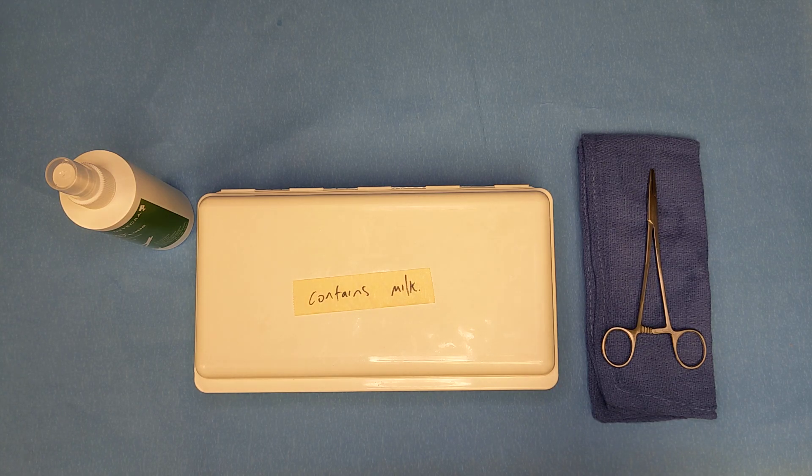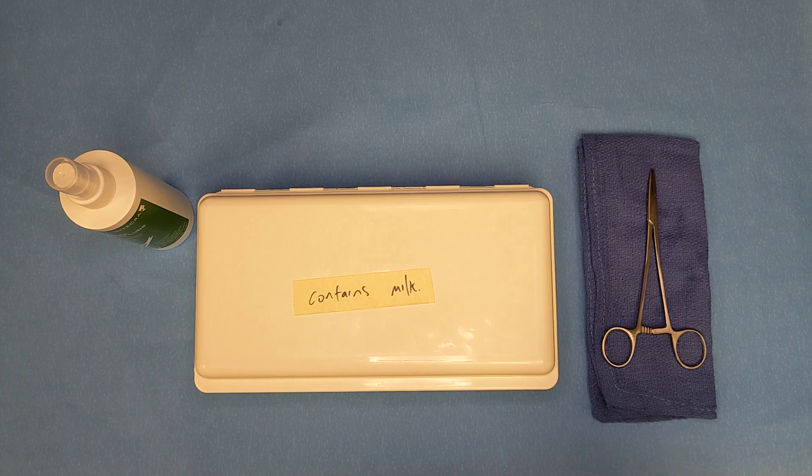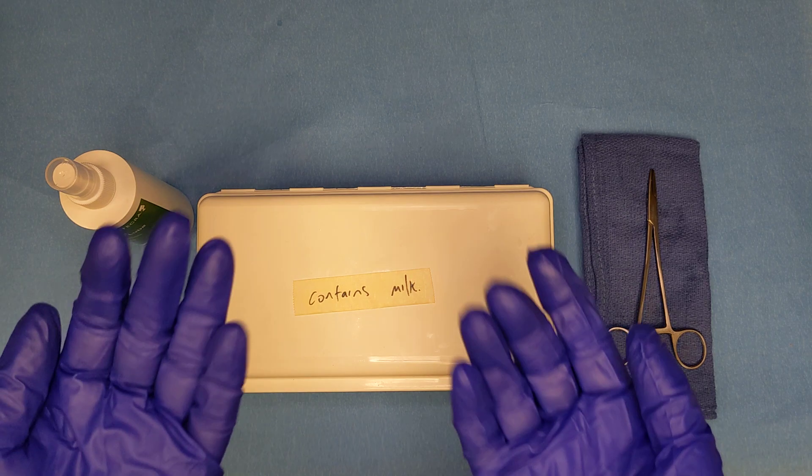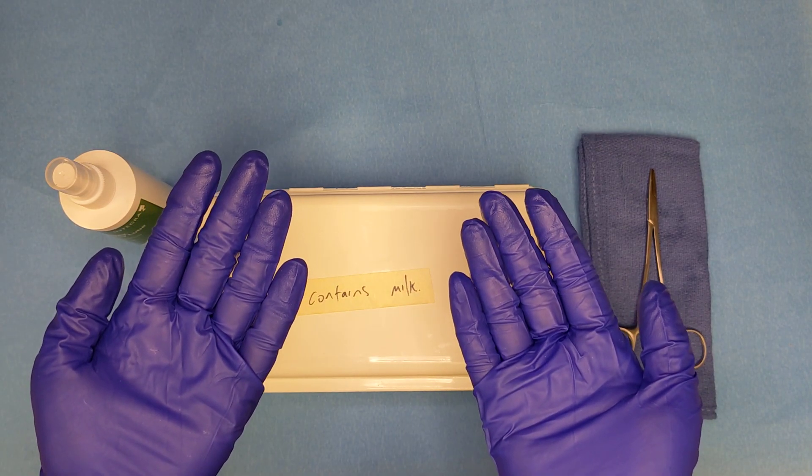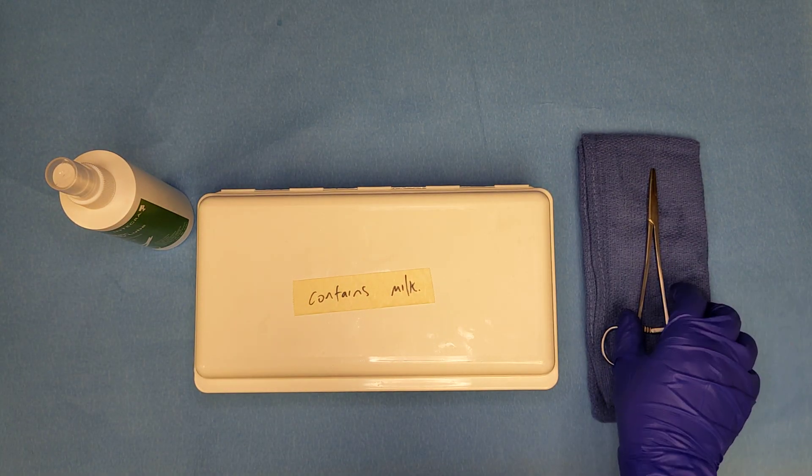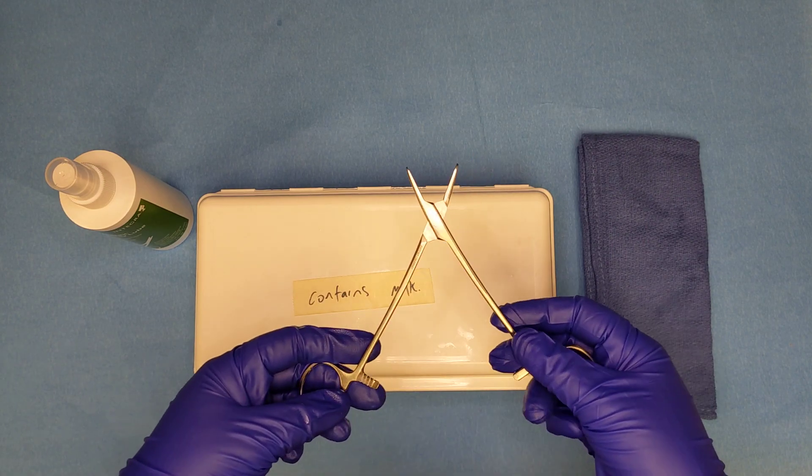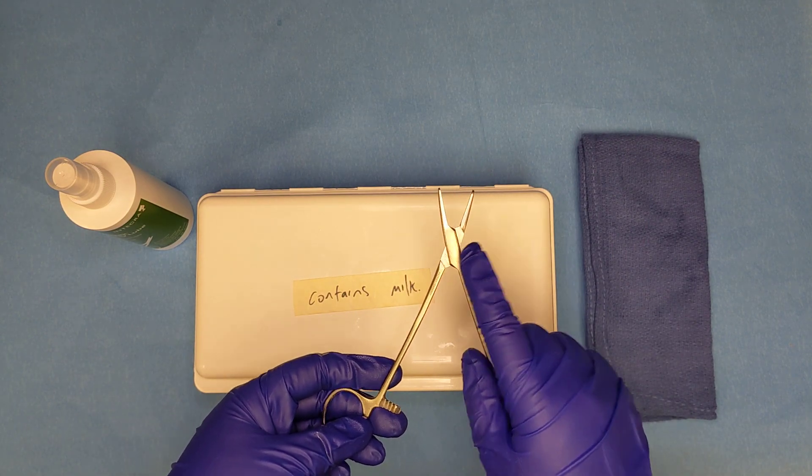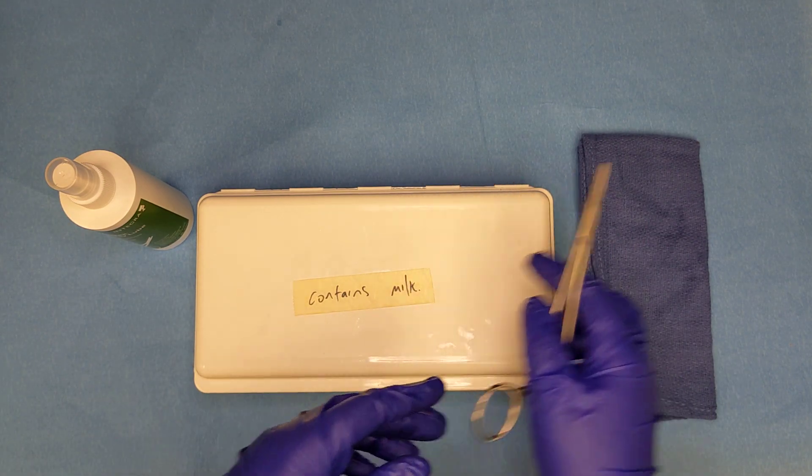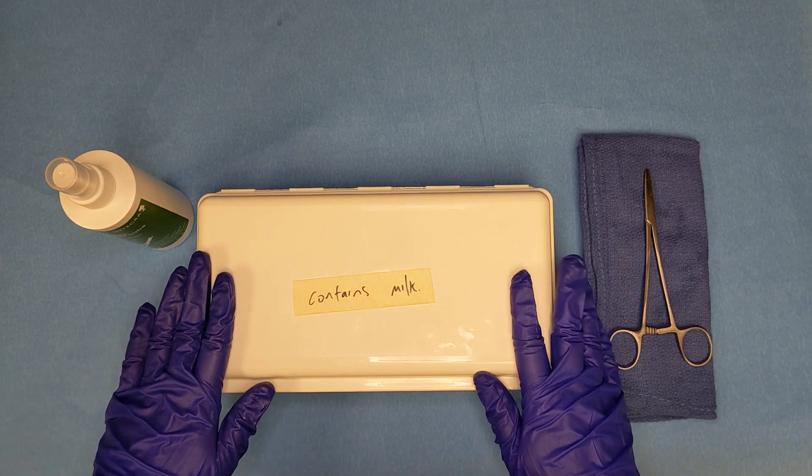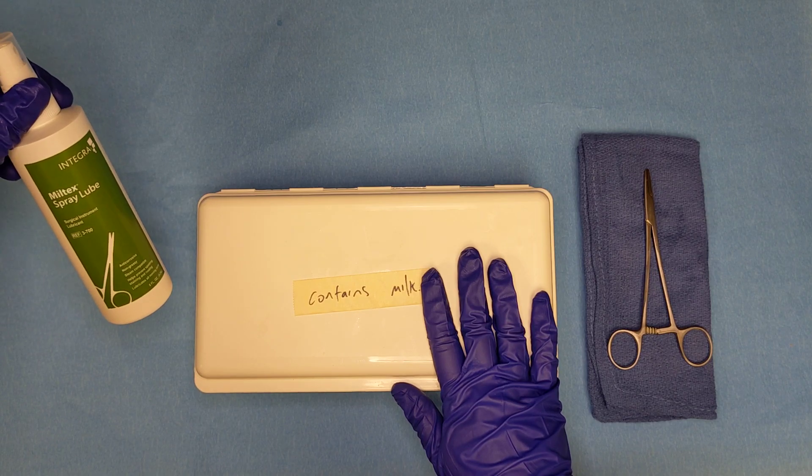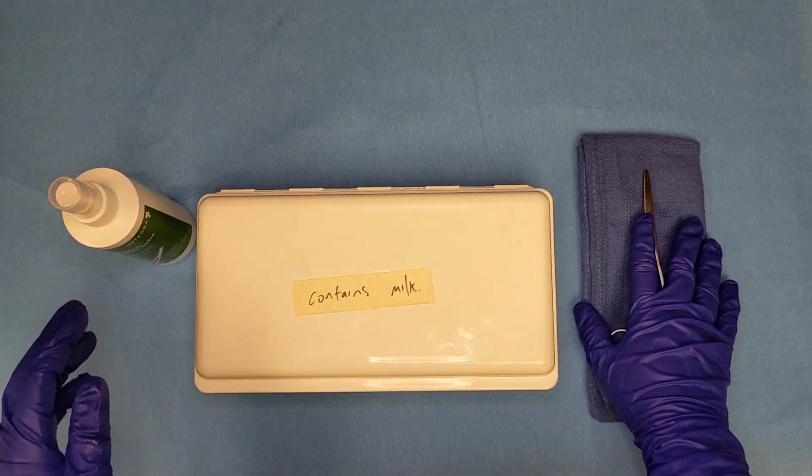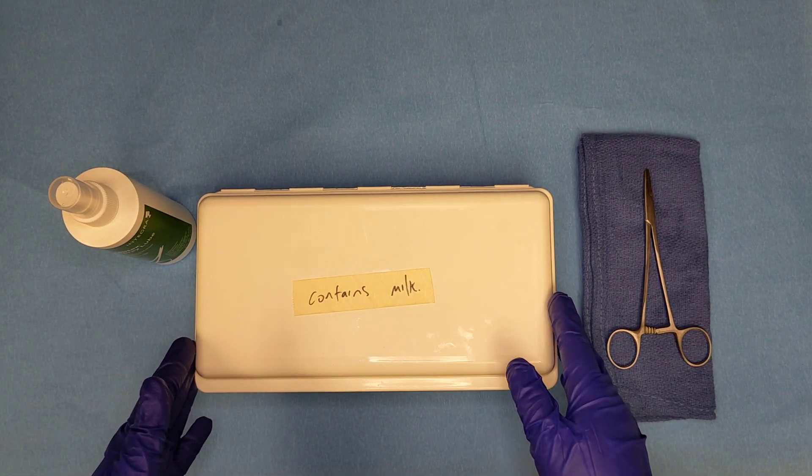The supplies that we need to perform instrument lubrication include our correct PPE, which is our gloves, because instrument lubrication is a chemical. We need our instrument with a moving part; in this case we have a needle holder with a box lock, so we need to lubricate the box lock. We need our lubrication container, your instrument lubricant, and then a soft cloth just in case.